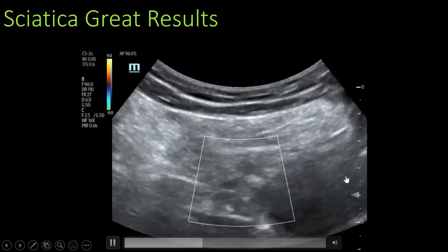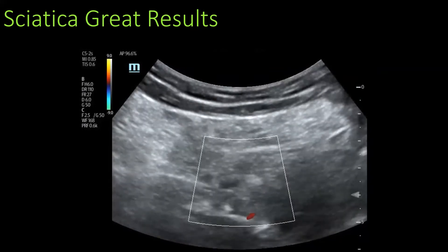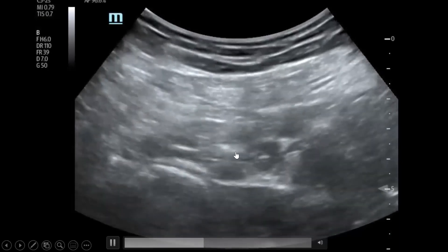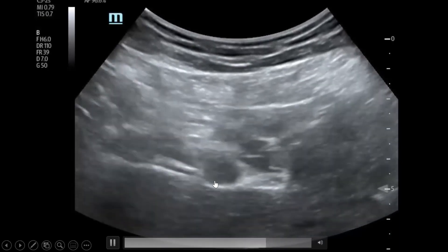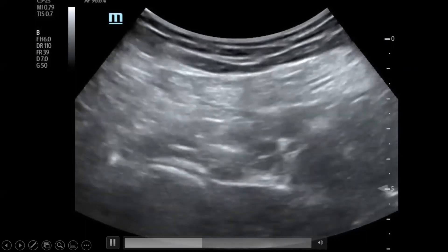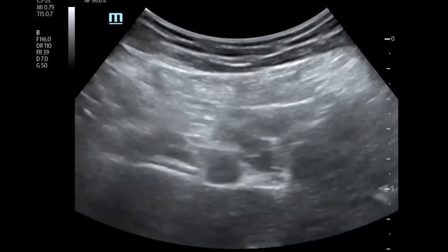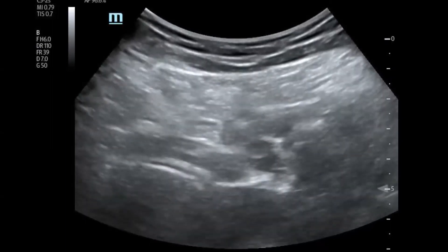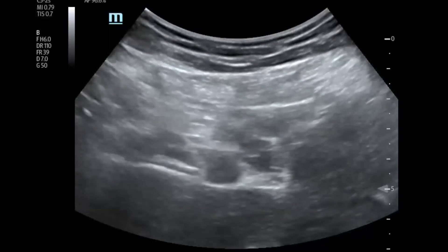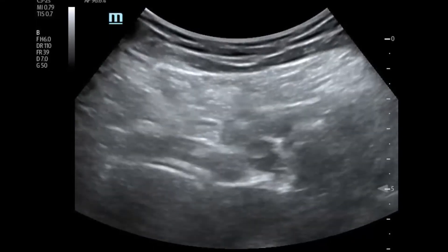Coming all the way down there — kind of rough visualization. But I think it's a good example of real life and sometimes how it looks, frankly. Coming here, you can see the nerve there, trying to aim for that fascia plane right there. We got some fluid around there. The patient came in barely able to walk and left walking and standing — it's kind of incredible. I've never heard of anyone doing this who has had significant motor blockade from it.